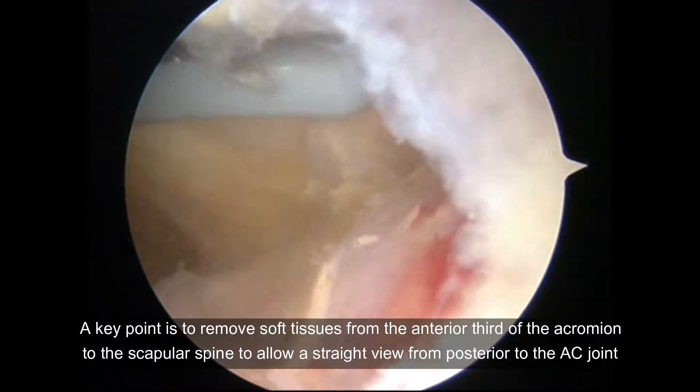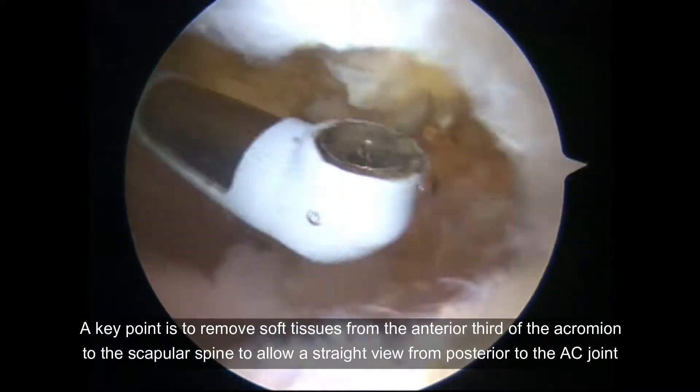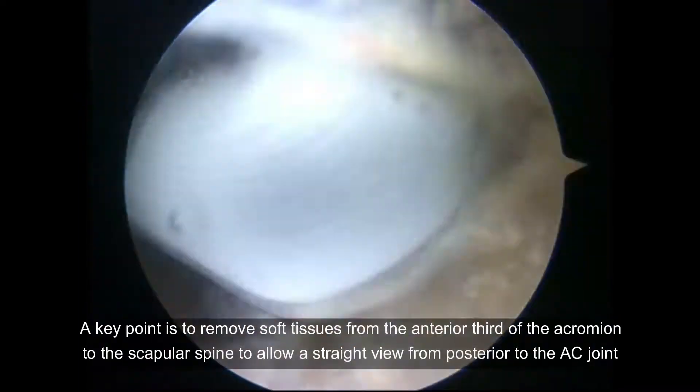A key point is to remove soft tissues from the anterior third of the acromion to the scapular spine. This allows a straight view from posterior to the AC joint.